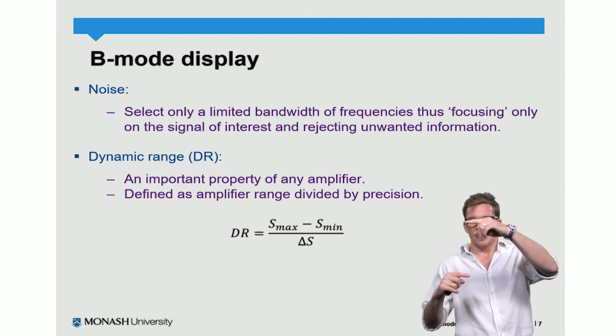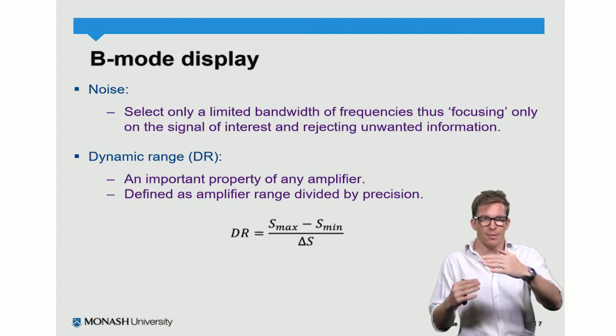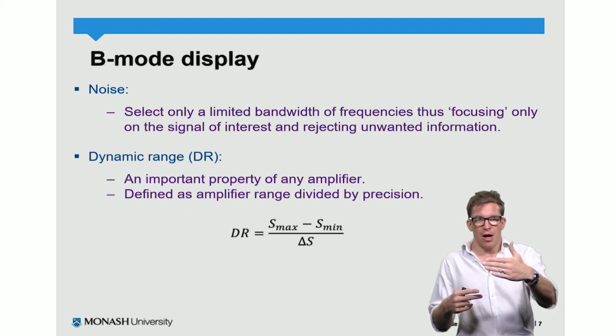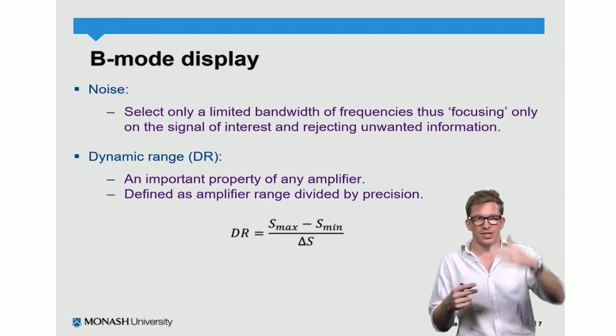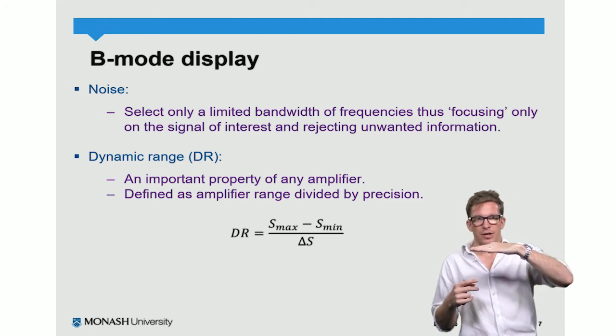So you can imagine if we had a thermometer that was measuring the temperature of something, say we were in the Sahara Desert. We know that the temperatures are going to be high, so we want a system that is measuring temperatures from, say, 10 degrees up to 50 or 60 degrees. And we would want that in reasonable resolution.